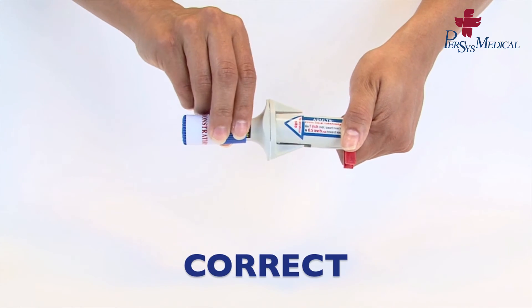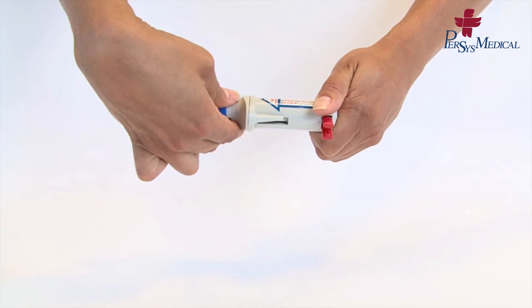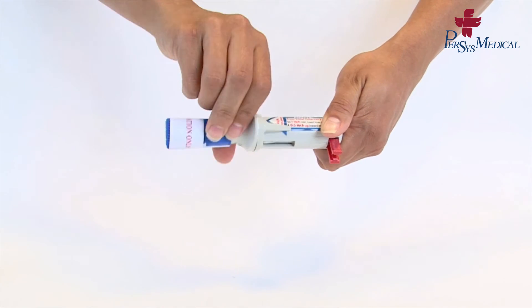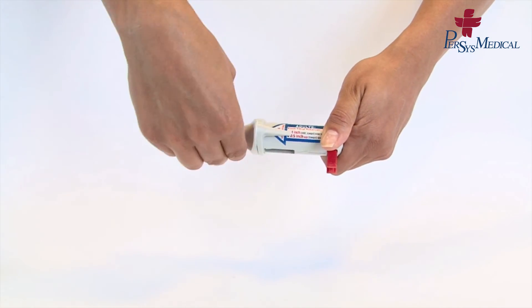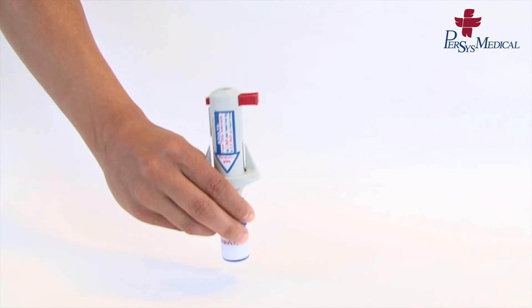Screw on the bottom barrel. The device is now ready to be used.